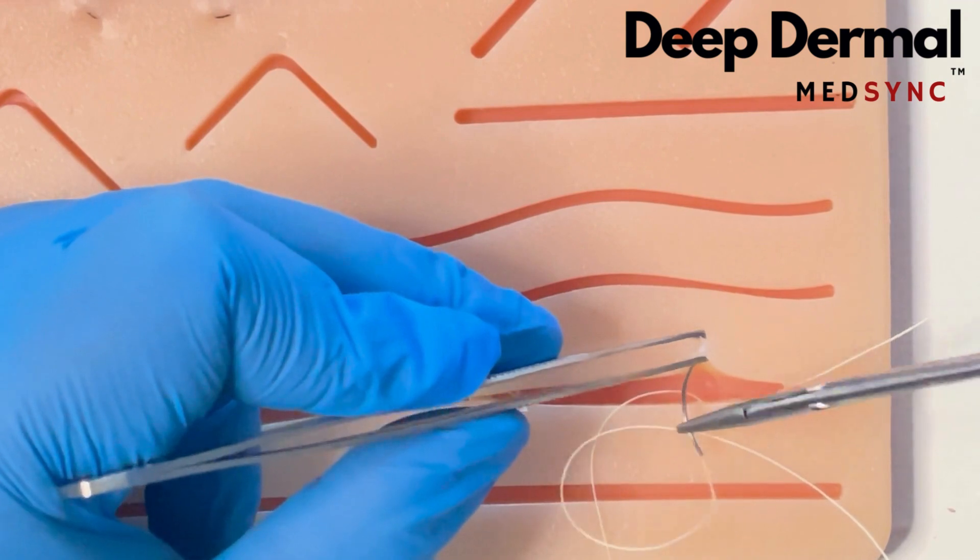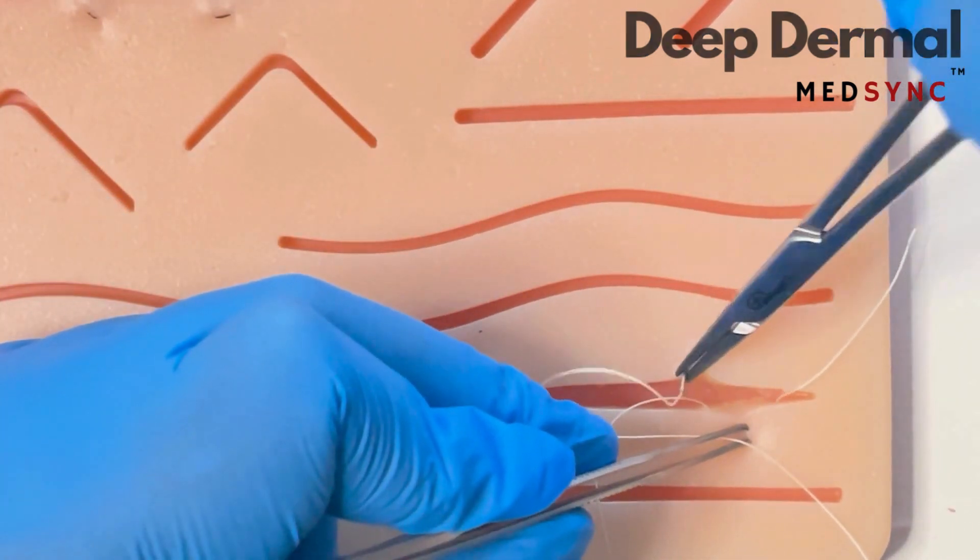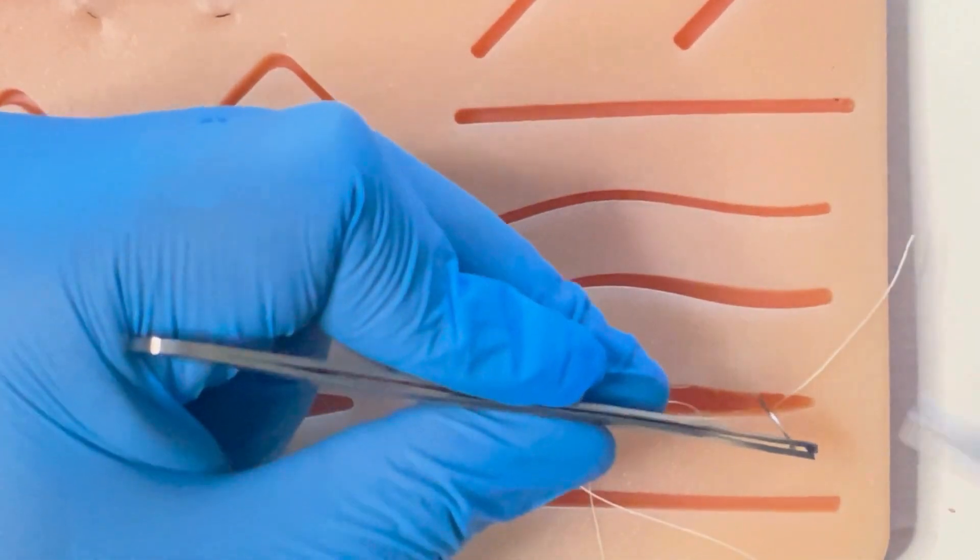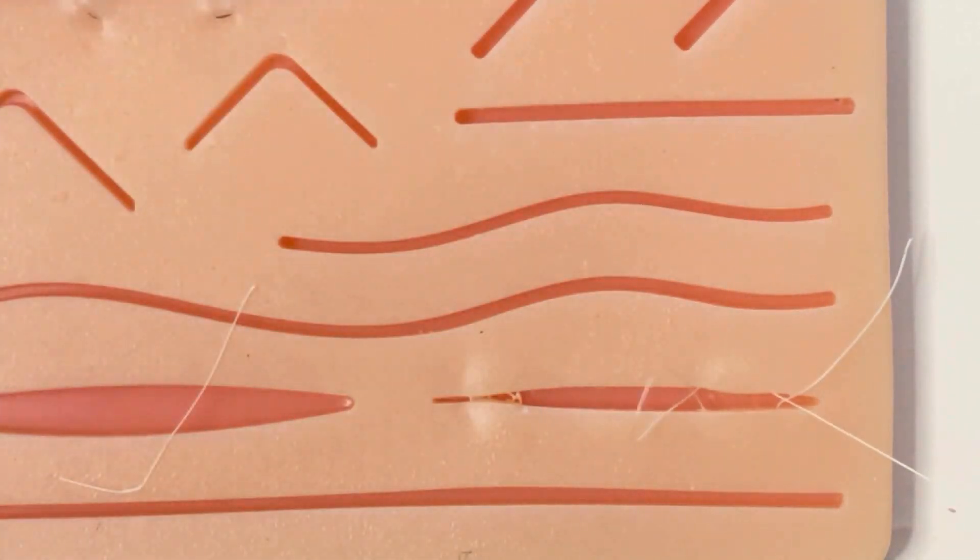On the other side, you enter superficial and exit deep. At no stage does your needle or suture material come through the epidermis.